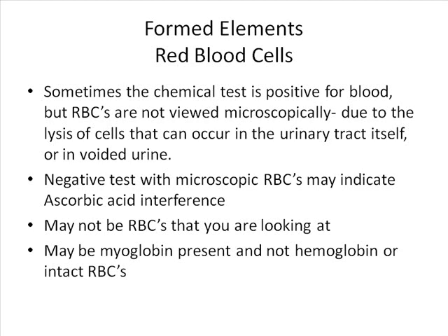So if you dip it and it is negative for blood, it's also going to be negative for myoglobin. I said what you need to do is maybe wait, because the guy was just electrocuted and they were doing things with him. I said give him a couple hours and then collect the urine again. Give the renal system time to actually filter out the myoglobin.